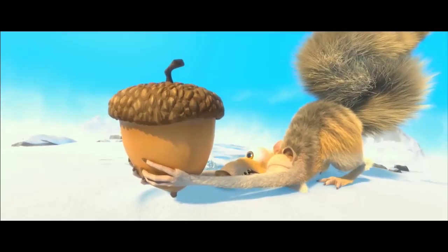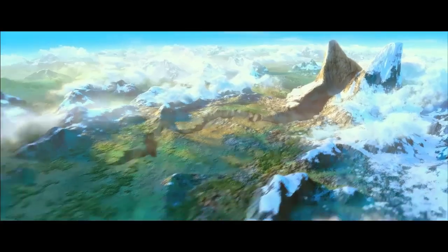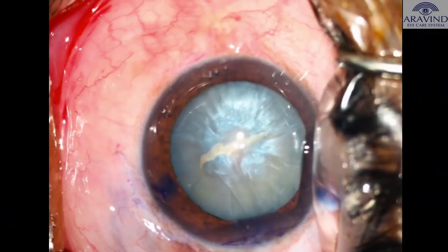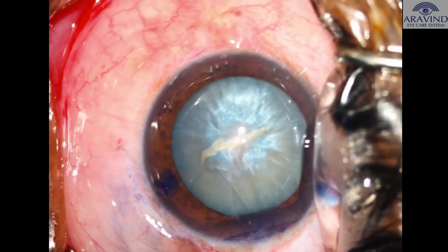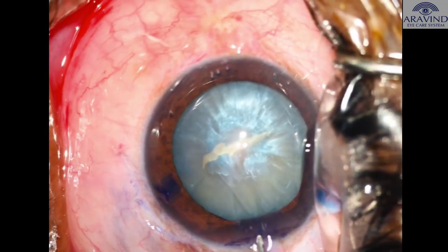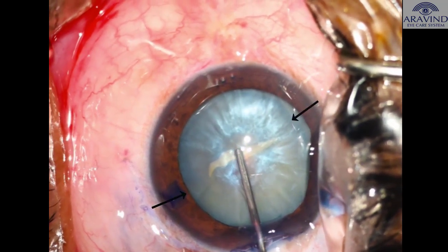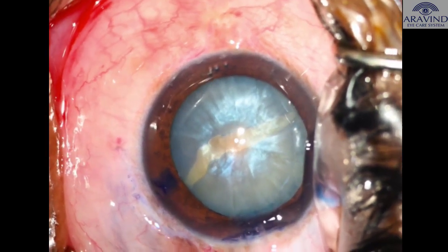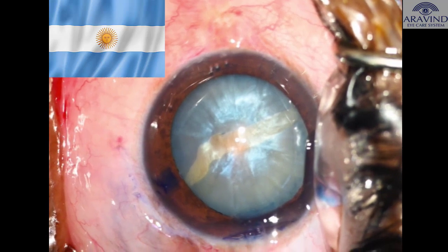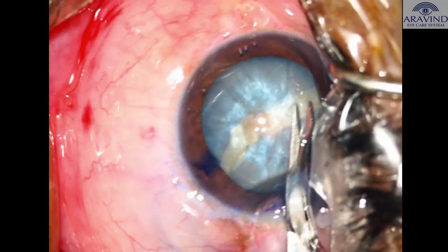Management of the Argentina flag sign. One of the common complications during surgery on intumescent white cataracts is the Argentina flag sign. A nick is made on the anterior lens capsule, following which there is an uncontrolled self-propagating radial tear in the anterior lens capsule. We see the white lens matter flanked on either side by the trypan blue stained anterior lens capsule, which resembles the Argentinian flag.